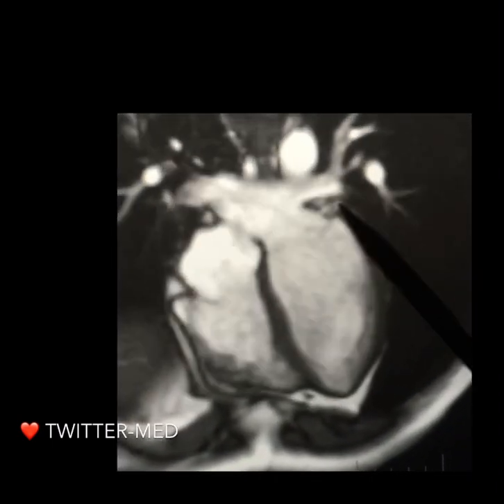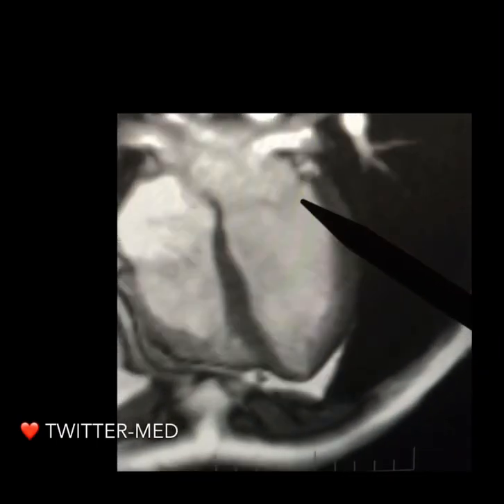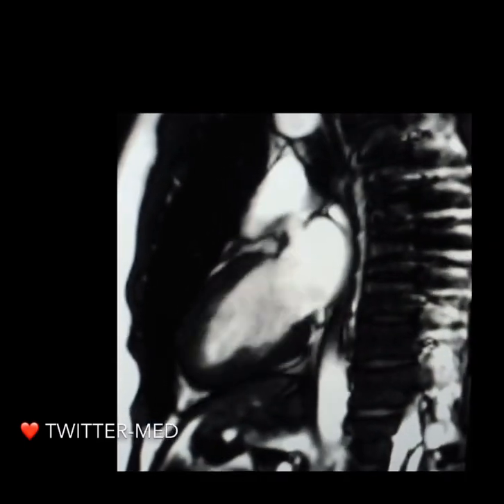So we can see the pulmonary veins pumping the blood into the left atrium. And we can see the mitral valve right here opening and closing, and that's pretty cool to look at. This is just a 2-chamber view of the heart, right? So you see the left ventricle and left atrium, I believe. Left atrium is pumping blood into the left ventricle, right? That's all we have to see here. We see the mitral valve, I believe, opening and closing.